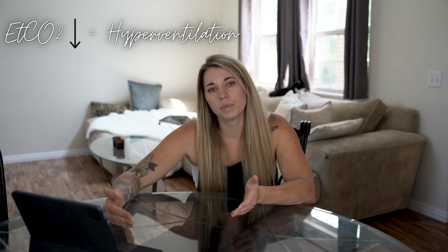When you're ventilating your patient, you are aiming for a normal end tidal CO2, somewhere around 35 to 45. Remember, cats can be naturally a little bit lower than that. If your end tidal is low, you are hyperventilating your patient, and you should decrease your respiratory rate and volume. If your end tidal is high, you are hypoventilating your patient and you should increase your respiratory rate and volume.